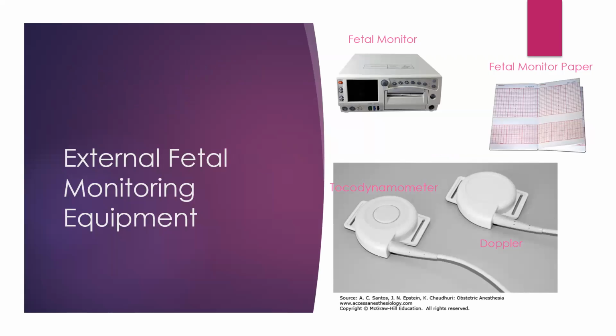Here you can note the external fetal monitoring equipment. At the very top, we have, of course, our fetal monitor. Every facility's fetal monitor is going to look different, but at the facilities that I've worked at, we've used this exact GE Healthcare fetal monitor. You'll utilize fetal monitor paper, which records the fetal monitoring wavelengths as well as the uterine contractions for easy reference.